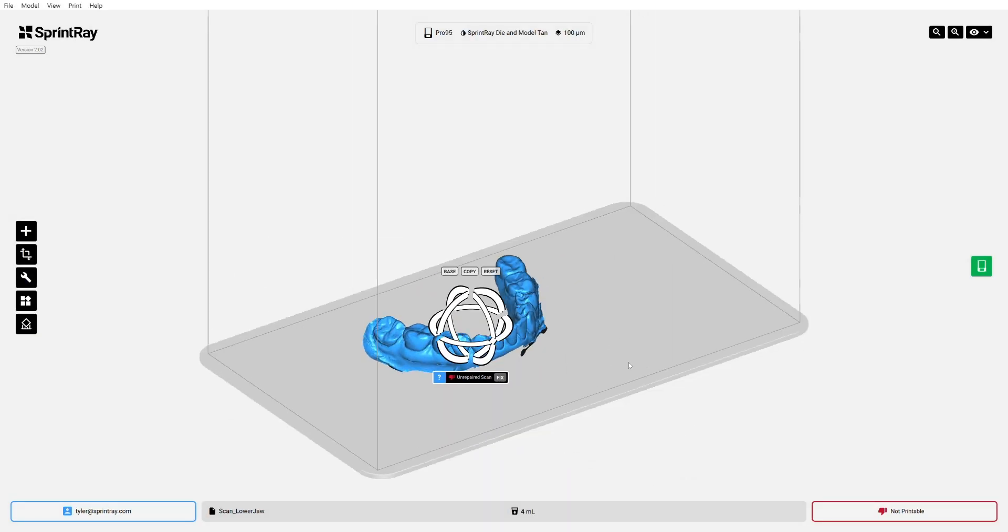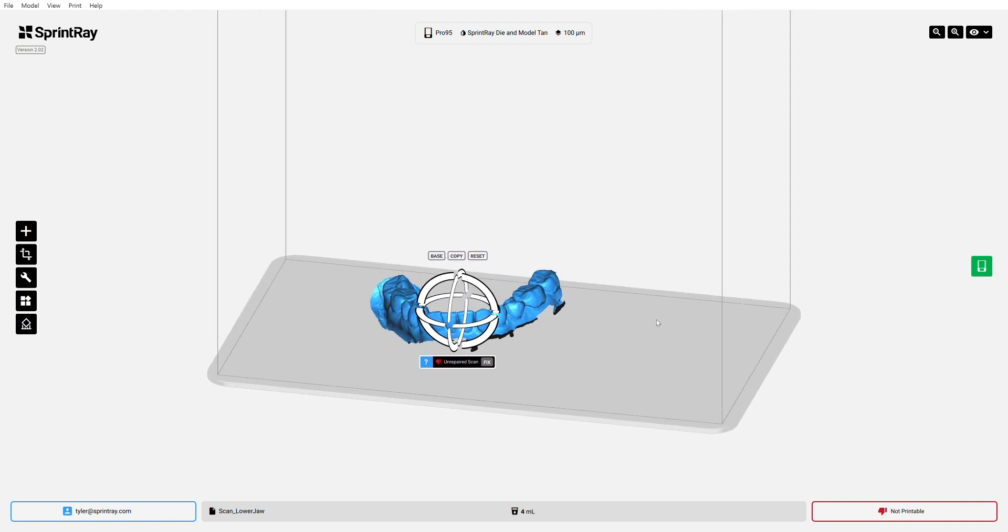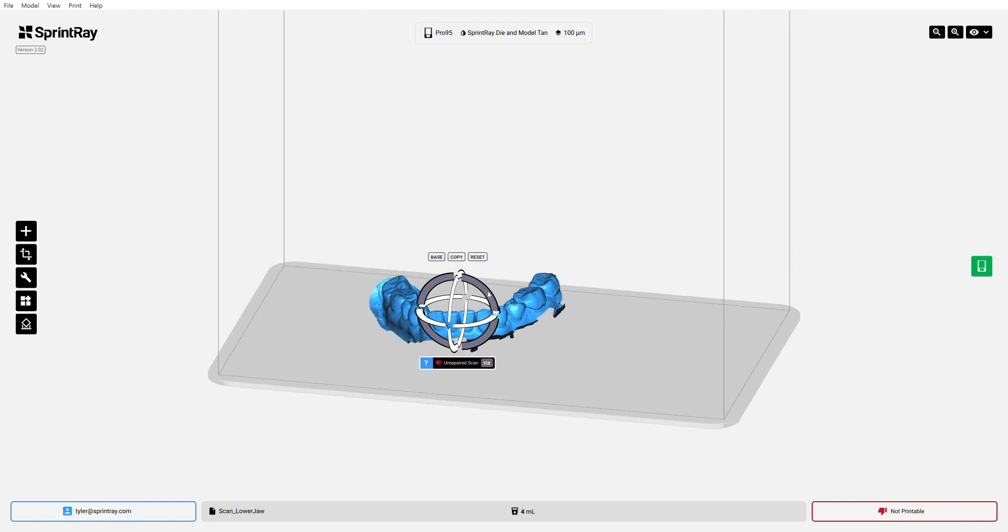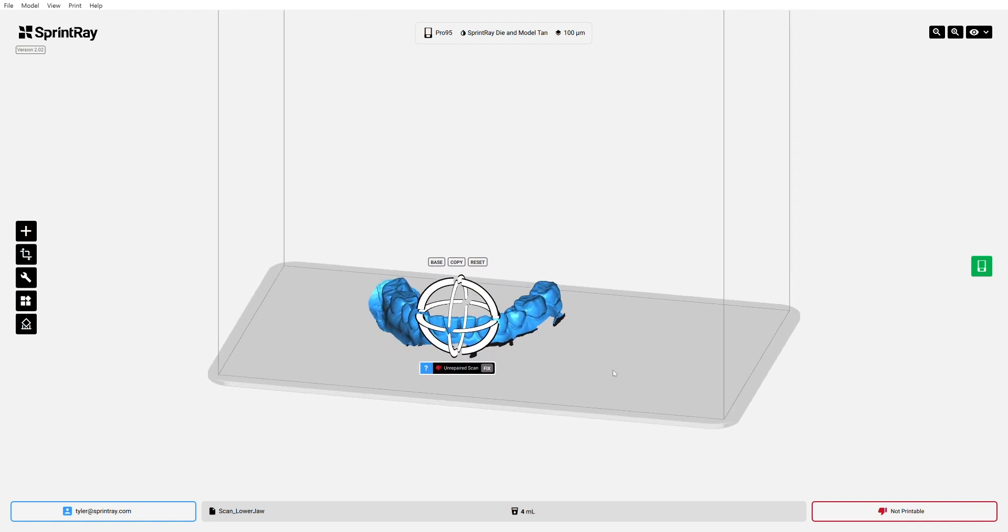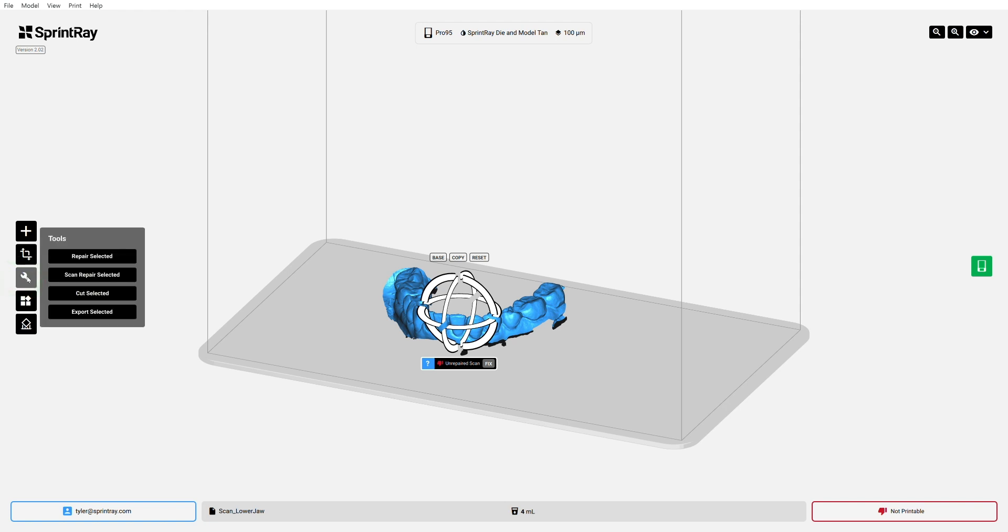So first, we've got to get this thing closed, and we've got to get a base on it so that we can print it. So once I select my model and it turns blue, I'm going to go over here to my tools section. I'm going to open that up. We're going to see four new tools. Today, we're going to be dealing with the bottom three. So to start off with, I need to get this thing based. So I'm going to select scan repair selected.